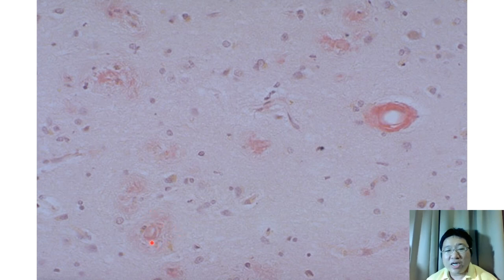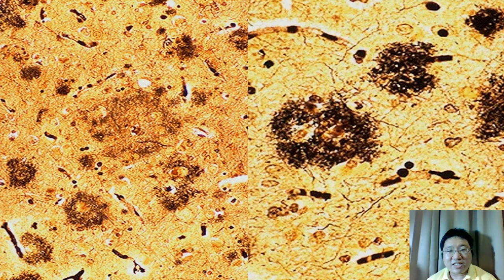But not only amyloid beta, actually the abnormal neurites are still entrapped here. But if I ask what protein is in here, that is amyloid beta. So the first one, neuritic plaque, amyloid beta. Here is a silver stain, which demonstrates that the neuritic plaque is composed of not only amyloid beta, but also abnormal neurites. These lesions can also be seen in elderly people, but not so many. But in Alzheimer's disease, these lesions are plentiful.